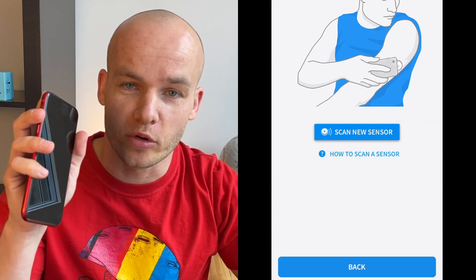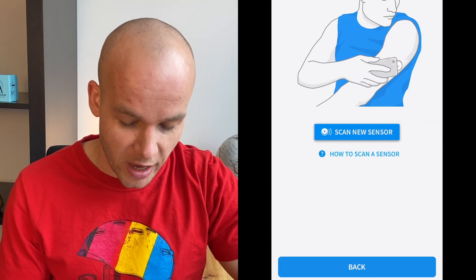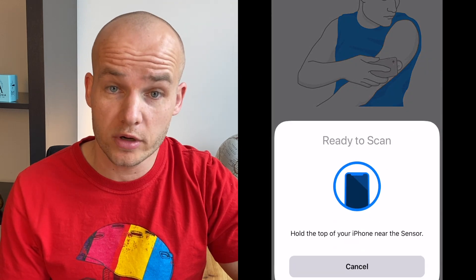Last but not least, you need to activate the sensor with your reader if you have one, or with your phone. To do that, press 'scan new sensor' on your reader or your phone and hold the top of your device above the sensor. When the sensor activates you will hear a beep, or feel a vibration if your phone is on vibrate. The sensor needs 60 minutes to adjust to your body, and after those 60 minutes it will provide blood glucose readings every time you scan for the next two weeks.